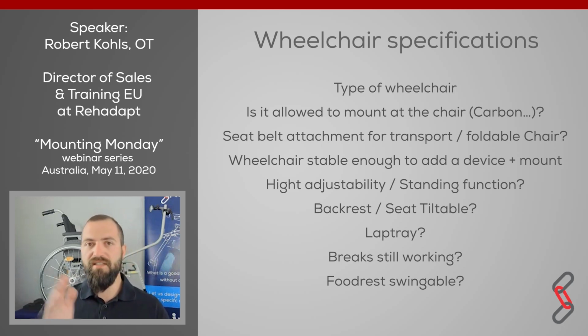It could be that the stroller or walker gets folded together when they want to put it into the back of their car. If the mounting components affect those folding options, the customer could get into trouble using the devices, and when they have trouble adjusting all the components, they might say, okay, it's too problematic to use on the wheelchair. We need to make that as smooth as possible.